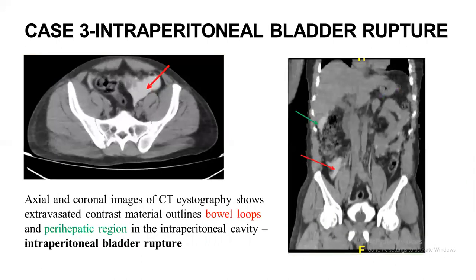Case 3 shows axial and coronal CT images demonstrating extravasated contrast material outlining bowel loops and the perihepatic and subhepatic region in the intraperitoneal cavity, suggesting intraperitoneal bladder rupture.